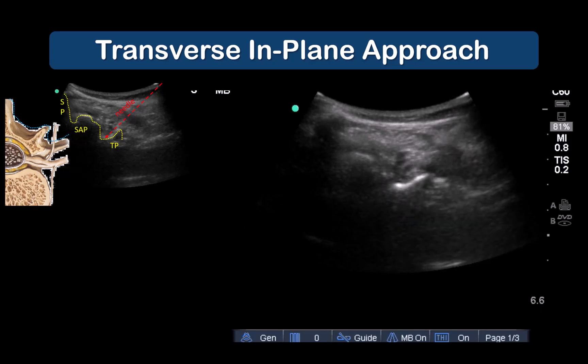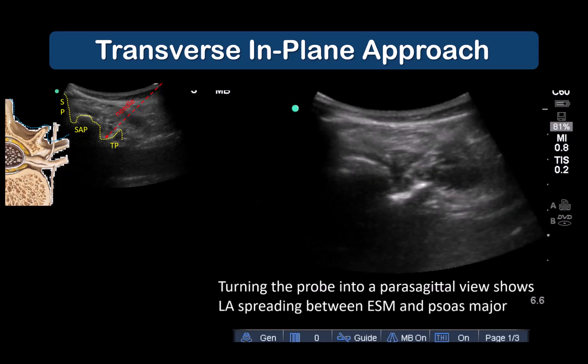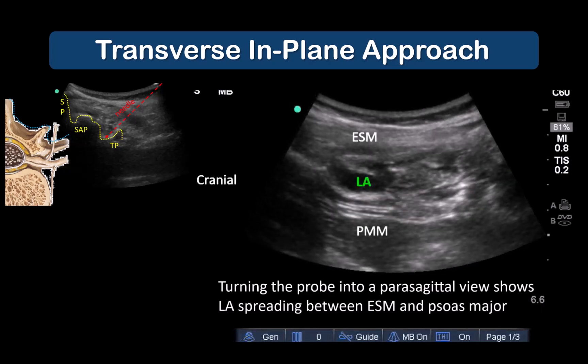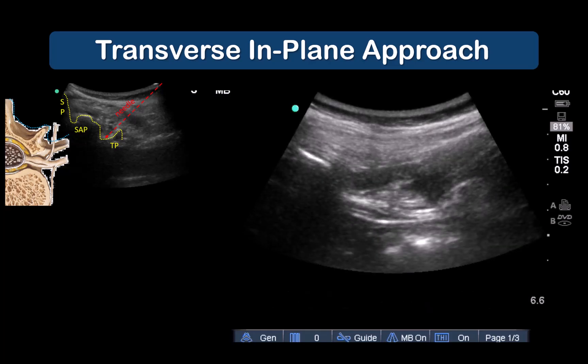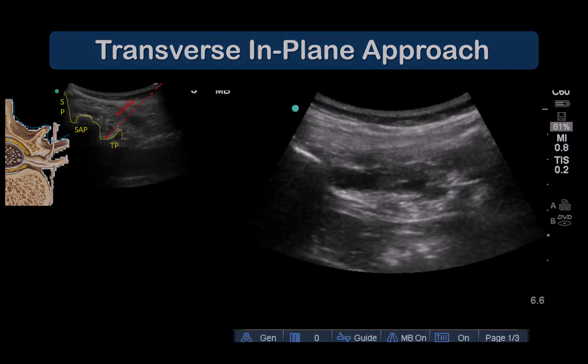Note that this imaging plane is similar to that of the thoracolumbar interfascial plane or TLIP block. A parasagittal scan shows local anesthetic spreading under the erector spinae muscle but above the fascia separating it from psoas major muscle.